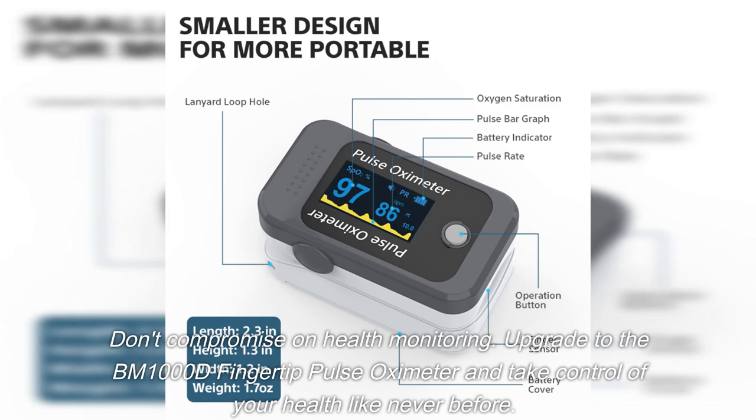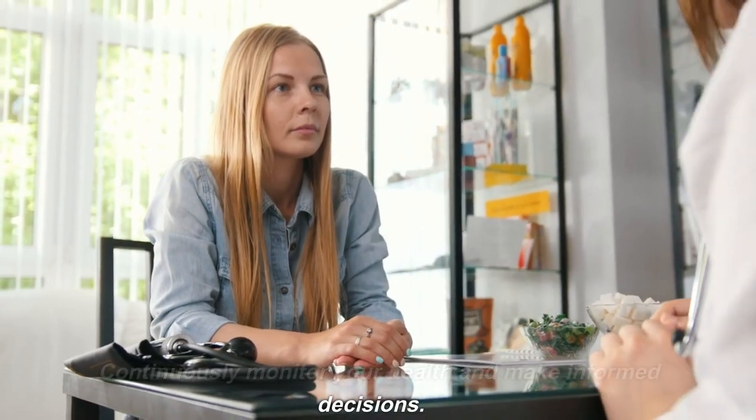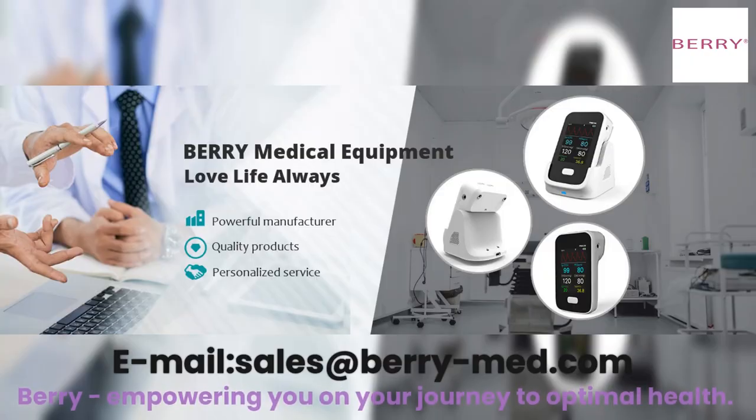Don't compromise on health monitoring. Upgrade to the BM1000D fingertip pulse oximeter and take control of your health like never before. Continuously monitor your health and make informed decisions. Empowering you on your journey to optimal health.